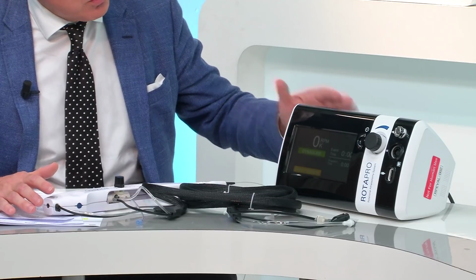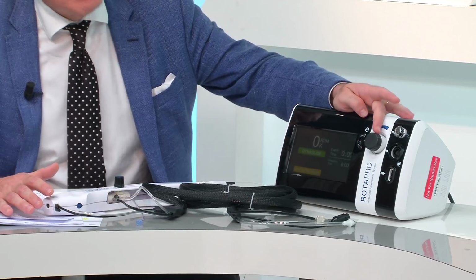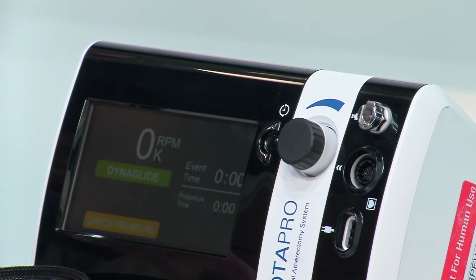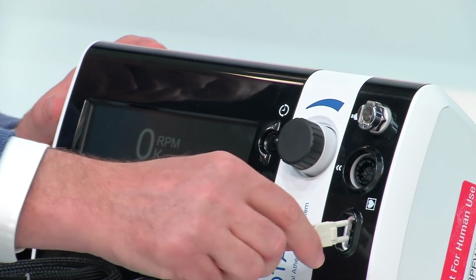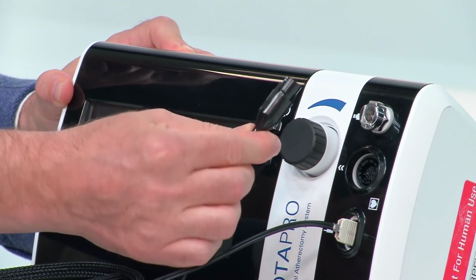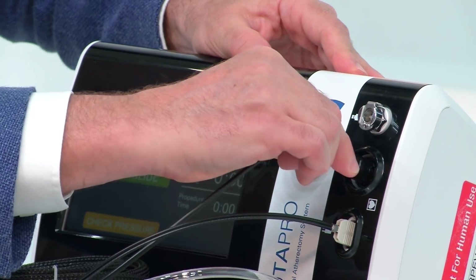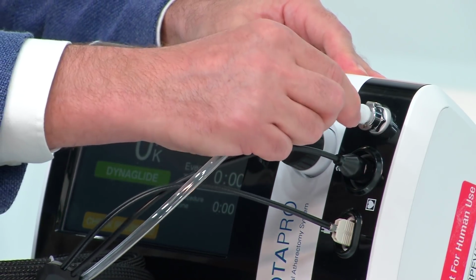You can see on the console a screen easy to be seen. You have also this ergonomic button over there that is there to modify the speed, and you will rotate it very simply. And finally, you have 3 plugins to easily plug the different connections. The first one is the fiber optic connection, and I could plug here. The second one is the power connection, and you can see here there is a small arrow, and you will plug easily the arrow in front of the other arrow like this. And the third and last one is the gas that we will easily connect also here.